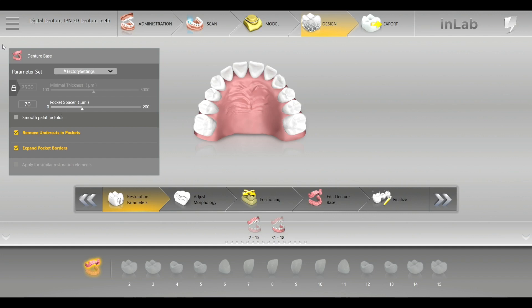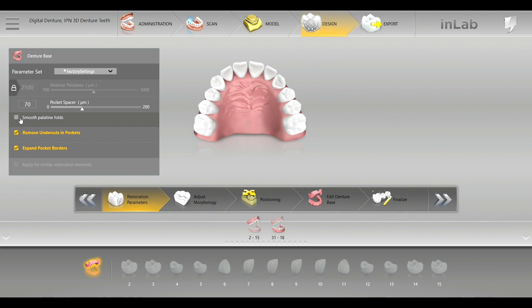Here's pocket space. Once you start getting into the design aspect, I always leave these on factory settings. You can change the thickness if you want, but at a minimal thickness of about 2.5 millimeters, you're pretty good. Right here — smooth palatal folds — that will actually recreate the natural rugai of the upper dentition.